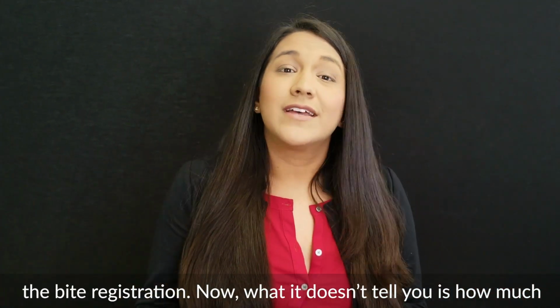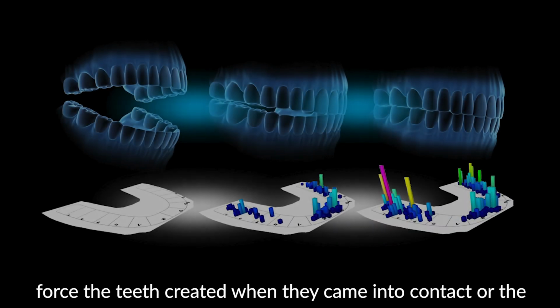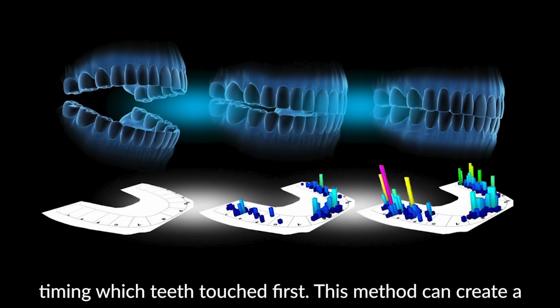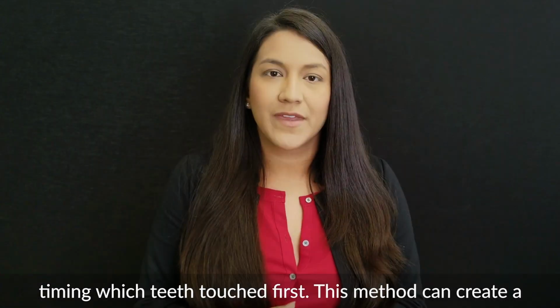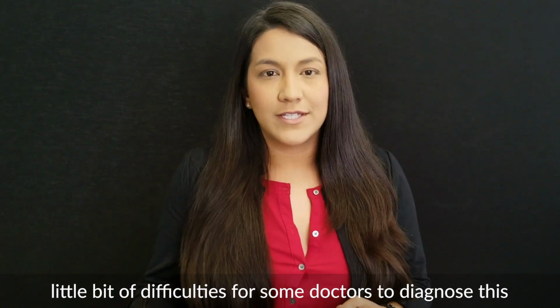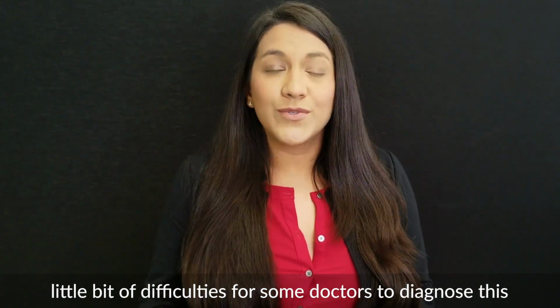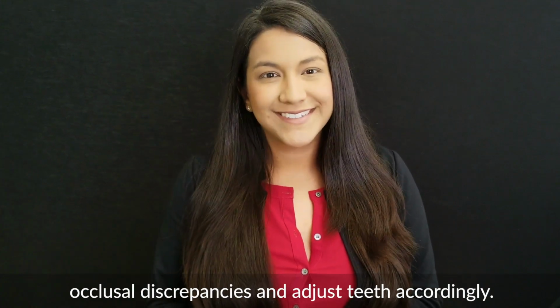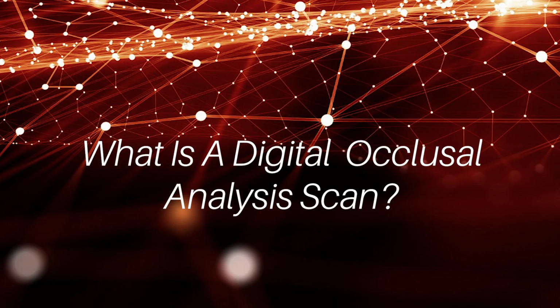Now, what it doesn't tell you is how much force the teeth created when they came into contact, or the timing, which teeth touched first. This method can create a little bit of difficulties for some doctors to diagnose these occlusal discrepancies and adjust teeth accordingly. So, what is a digital occlusal analysis scan?